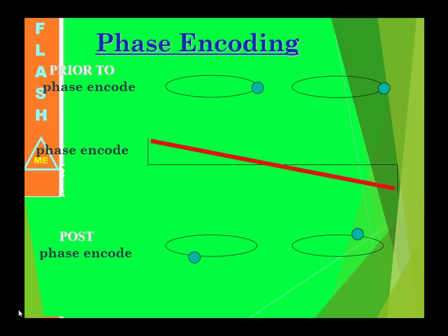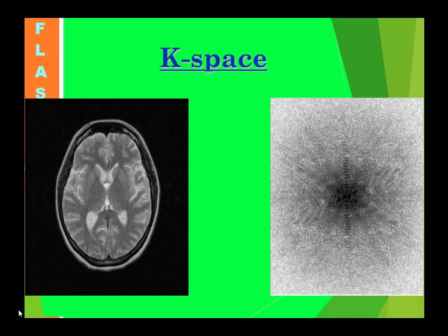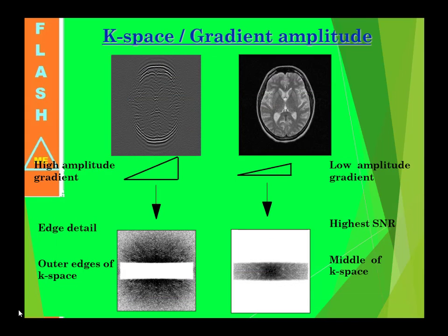Prior to phase encode, phase encode, post phase encode, phase encoding. K-space. High amplitude gradient, low amplitude gradient.